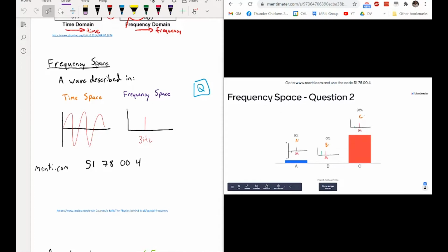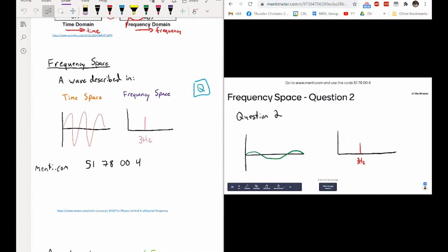If we want to represent a negative frequency, which is definitely possible, here I've drawn a sine wave again, starting at 0 and going up and then down. But if we had a cosine wave or anti-sine wave or something like that, then we could see a signal vary in the other direction.